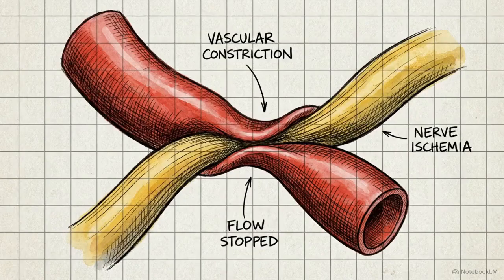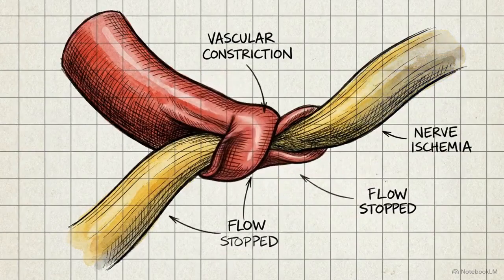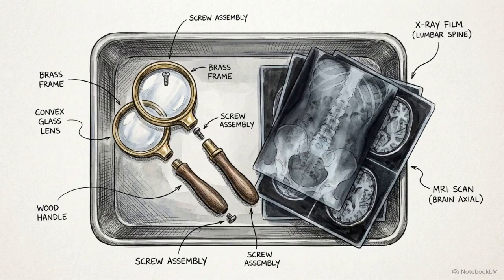Conversely, the primary internal threat is ischemic optic neuropathy, or ION. This acute condition is caused by vascular insufficiency, leading directly to nerve necrosis. ION will not produce the tram-track sign because the meninges are unaffected. To detect it, we need a different MRI sequence.